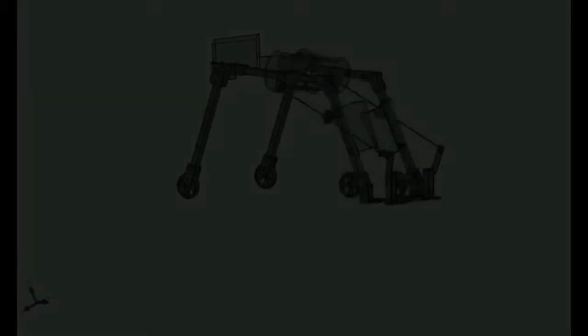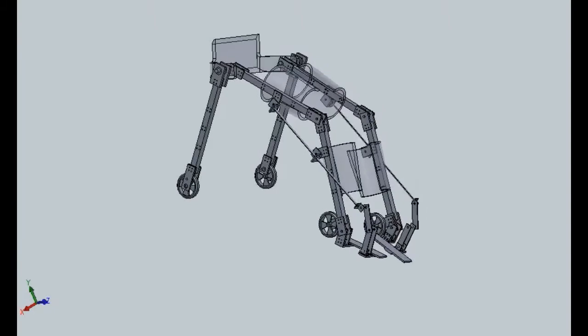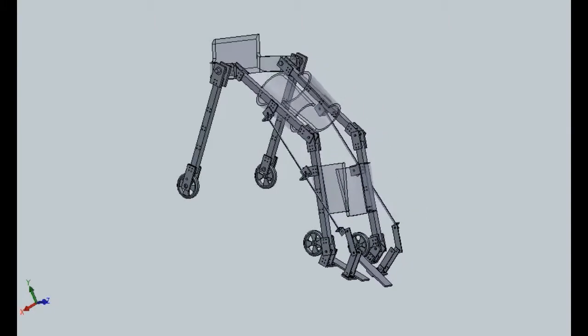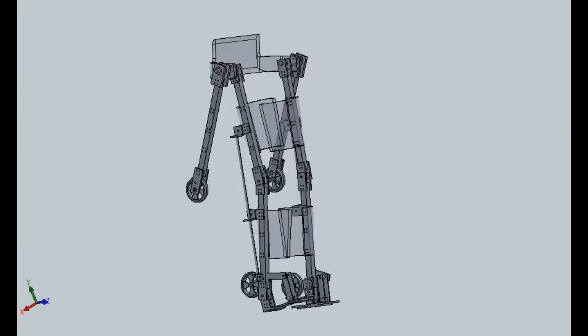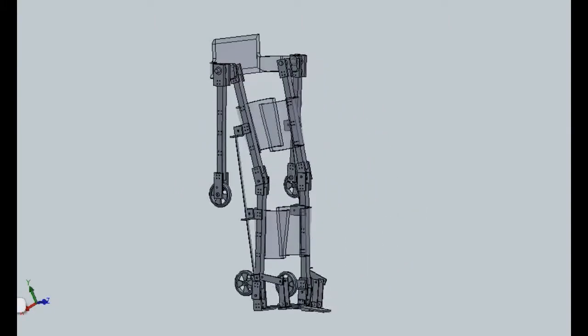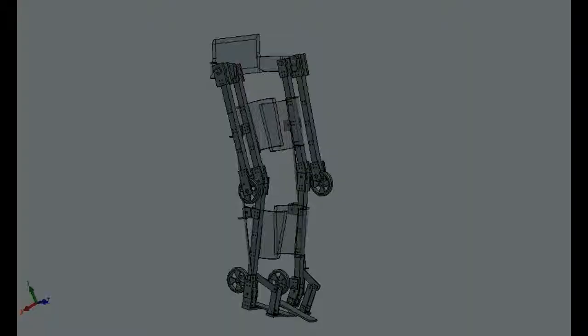On encountering obstacles such as stairs, the device can then be converted to an exoskeleton while the user is wearing it, thus helping the user to walk by themselves.